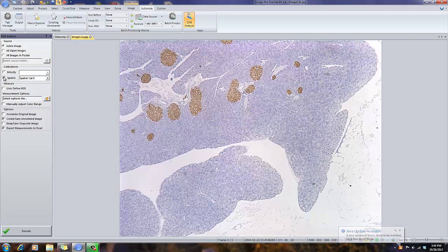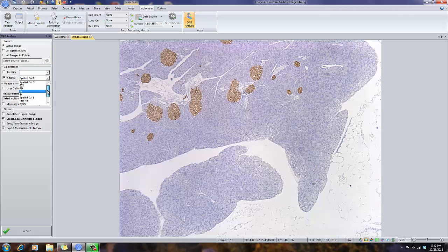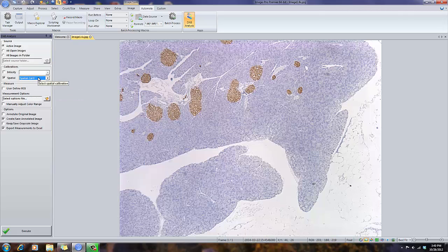If I have a spatial calibration, I can browse to that specific calibration. In this case, I'm just going to select a sample calibration that we supply with ImagePro Premiere.